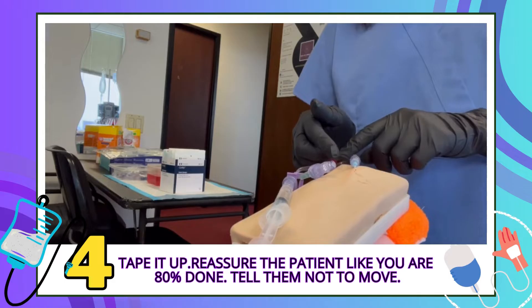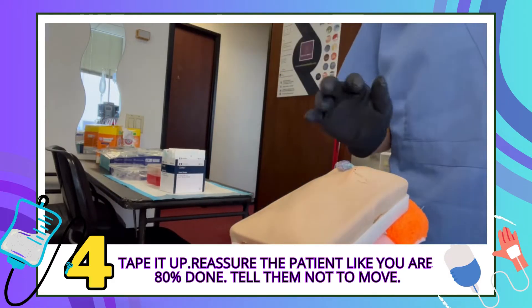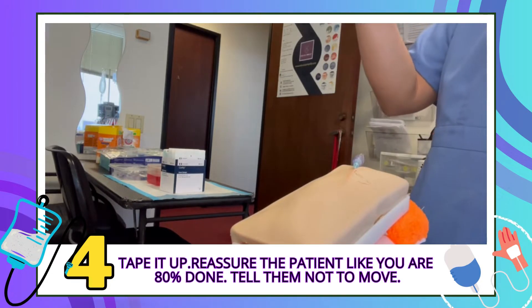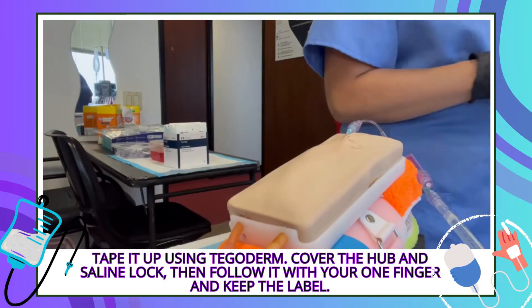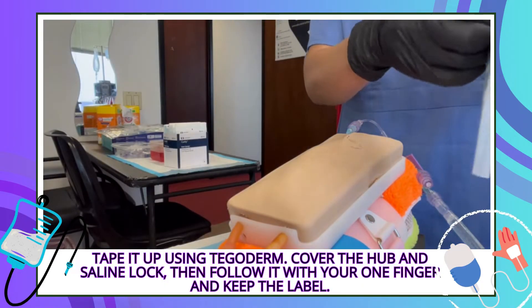Will this survive if the patient moves? No — we need to tape it up. The first thing you want to do is reassure the patient: we're about 80% done, please don't move. At this point they're irritated with you. I'm going to show the Tegaderm — the first tape to go on your IV.